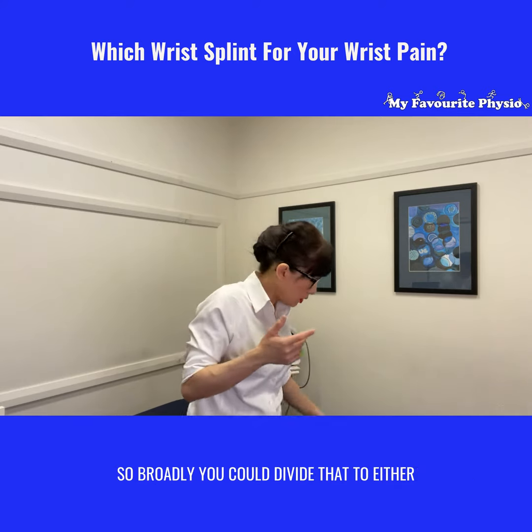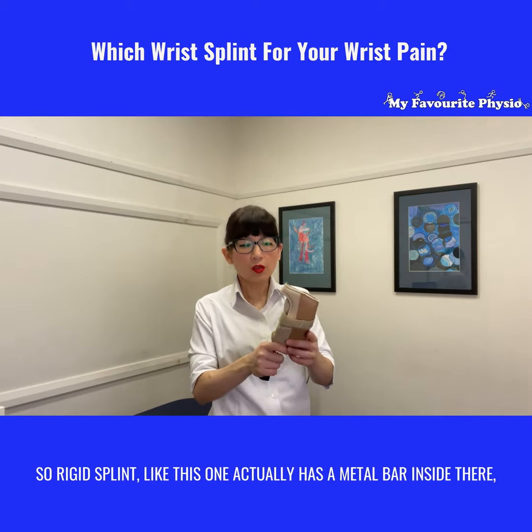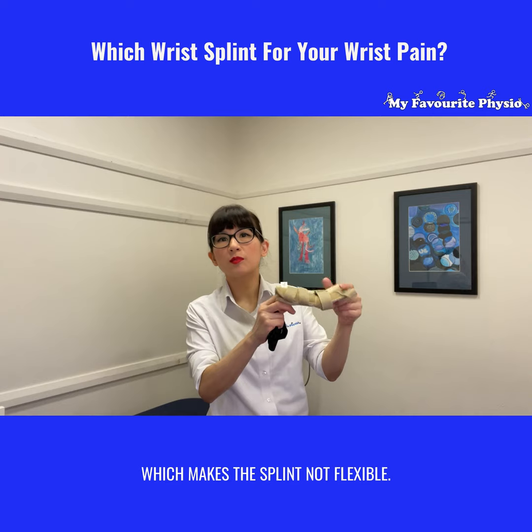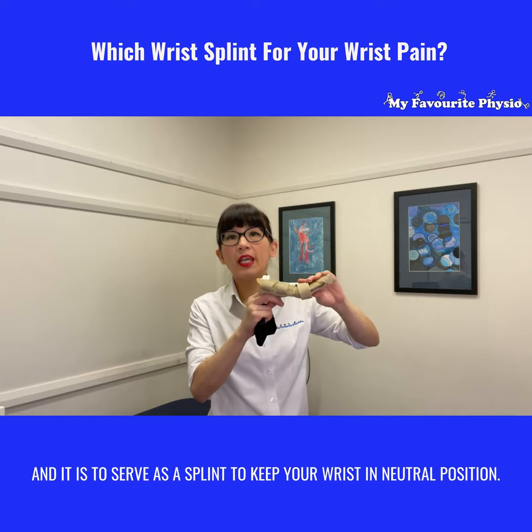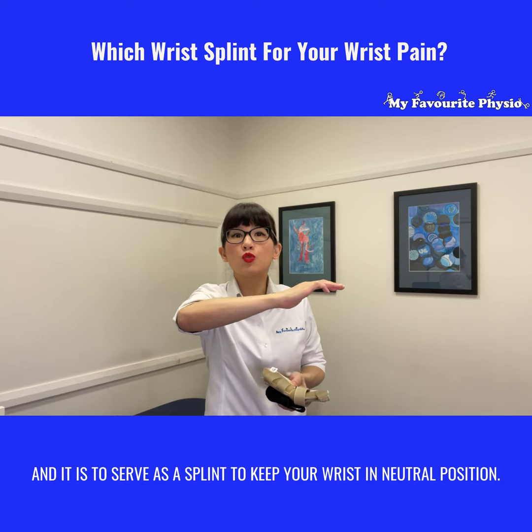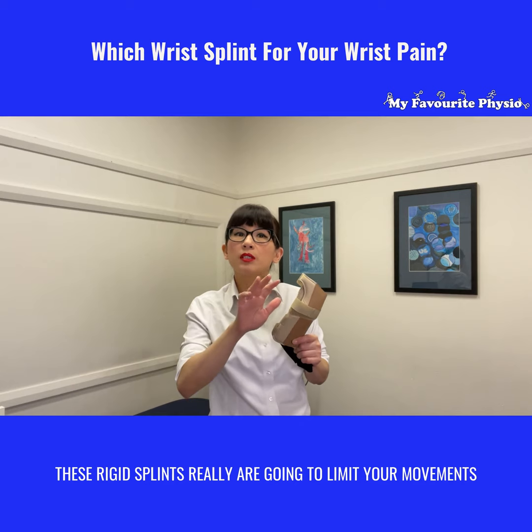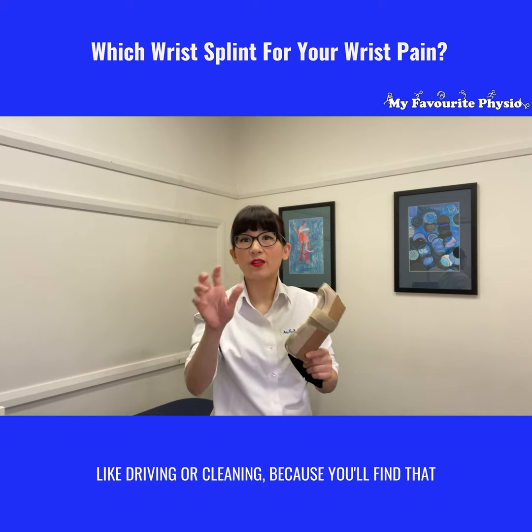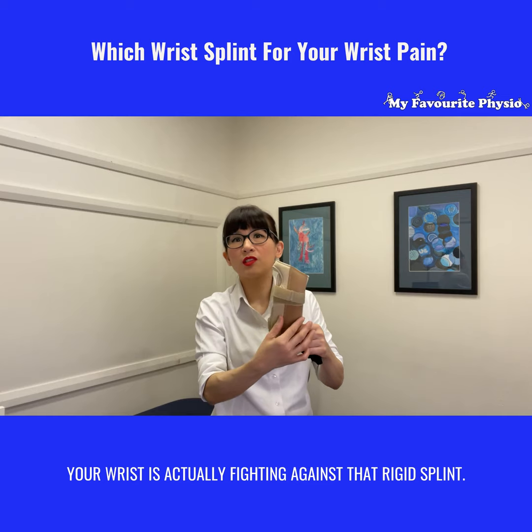So broadly, you could divide them into either a rigid splint or a dynamic splint. A rigid splint like this one actually has a metal bar inside, which makes the splint not flexible. So it's rigid, and it serves to keep your wrist in a neutral position. These rigid splints really are going to limit your movements. So you shouldn't be wearing it and trying to do activities like driving or cleaning, because you'll find that your wrist is actually fighting against that rigid splint.